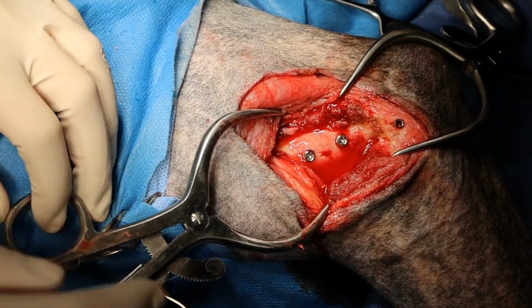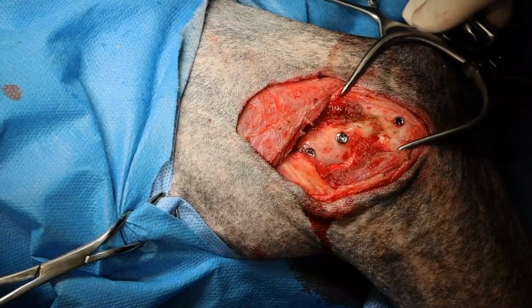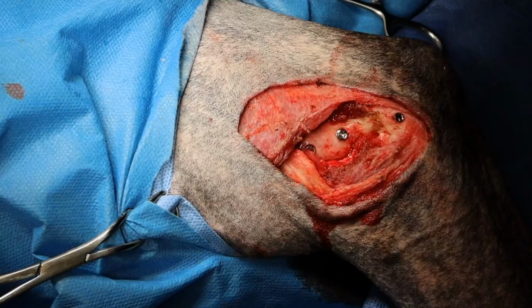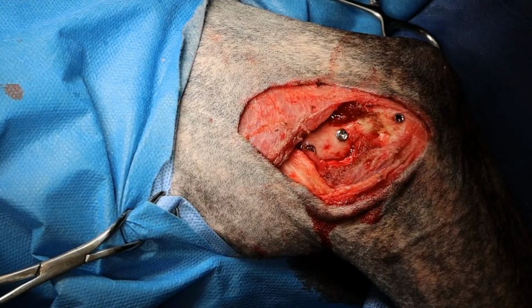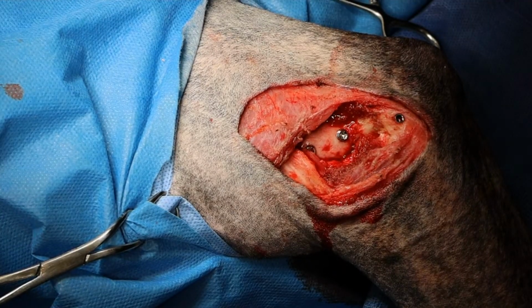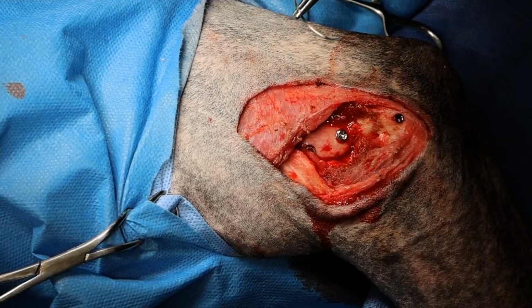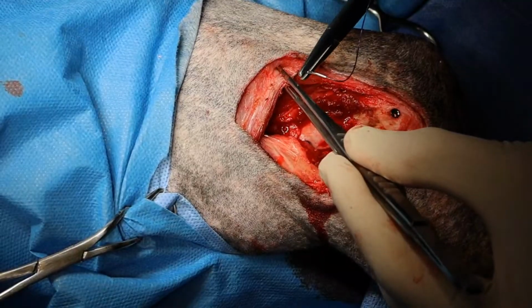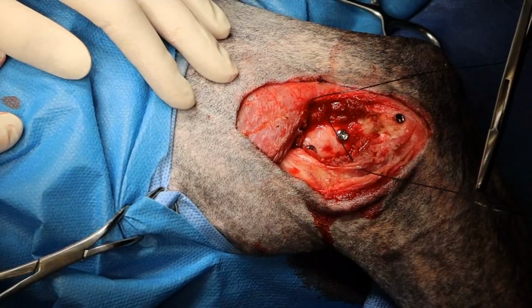And some PDS, please. So I use PDS because that's what we have on a taper needle. I always prefer taper needle over a cutting needle, except for very few situations. So, and I kind of was brought up on PDS, but monocryl for the intradermal layer would be completely fine.